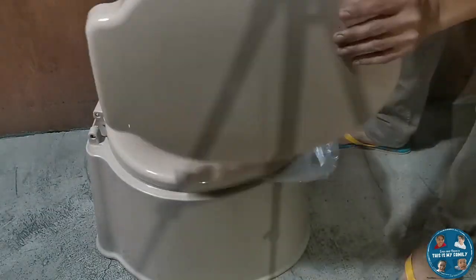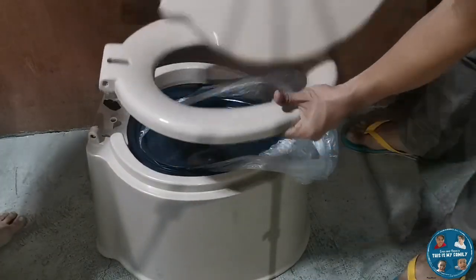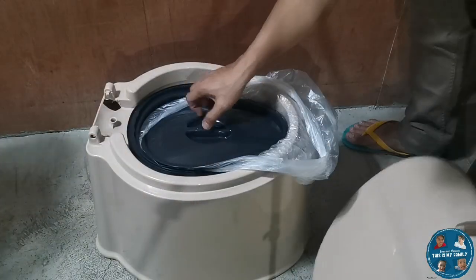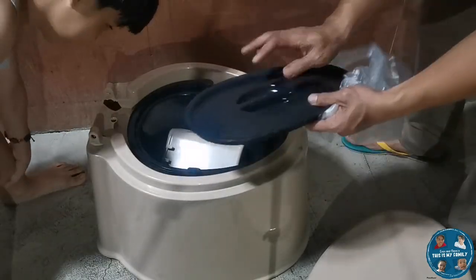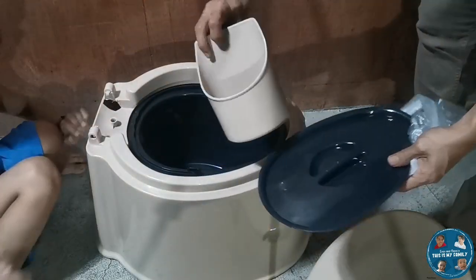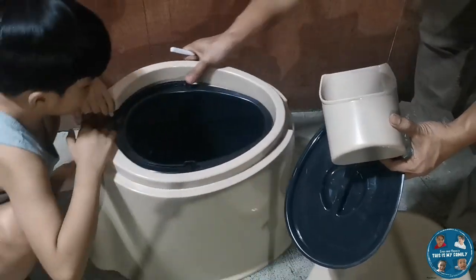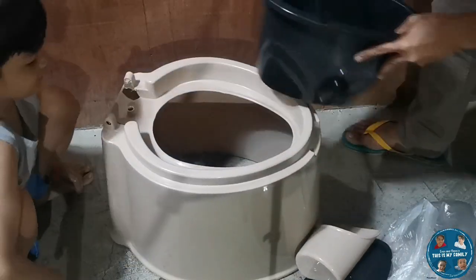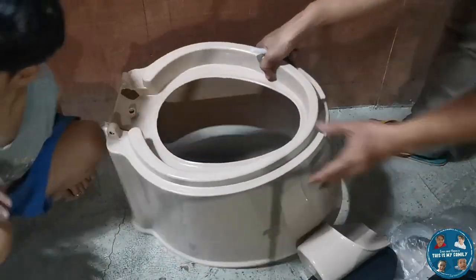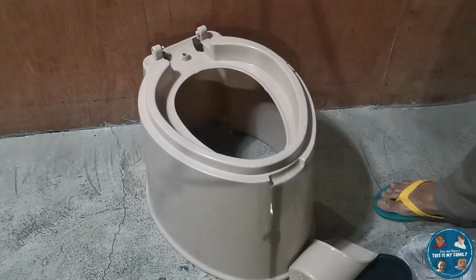First, we can see the outer cover, then this is the inner lid. And you can see inside the cover of the bucket — this is the storage area where you will put the garbage. So this is the inner bucket.